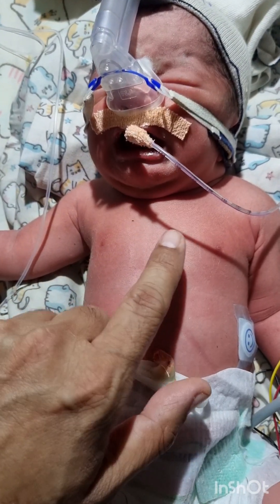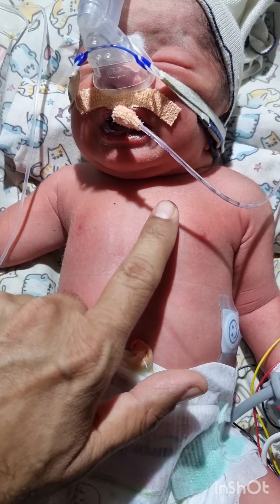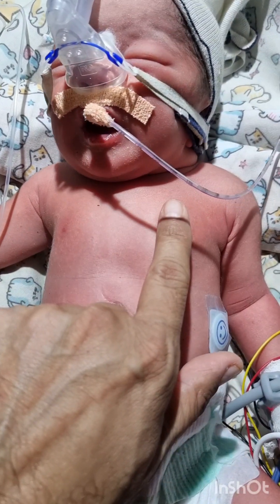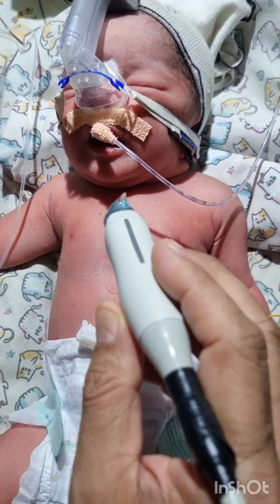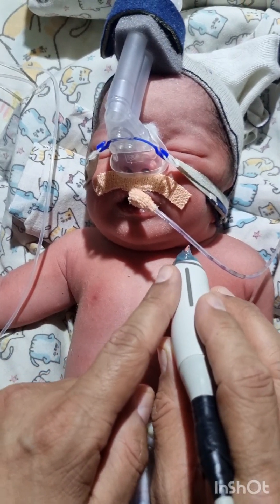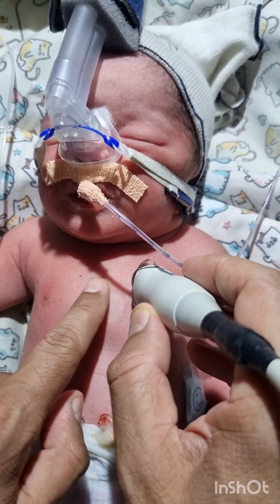For SVC diameter, the probe has to be kept on the left side of the sternum. You keep the probe pointer pointing at 12 o'clock, above the nipple line, on the left side of the sternum.